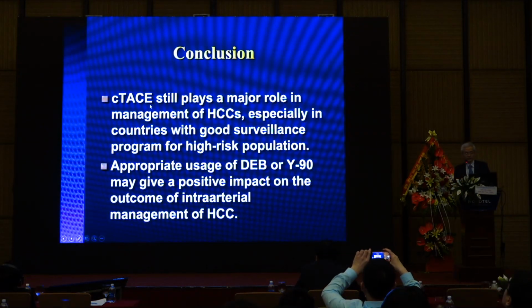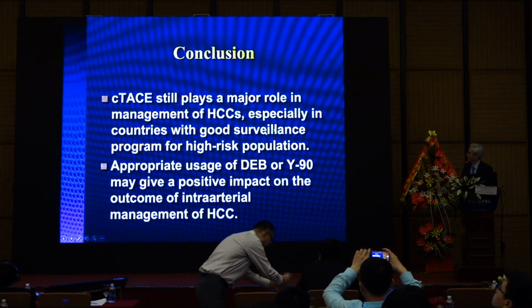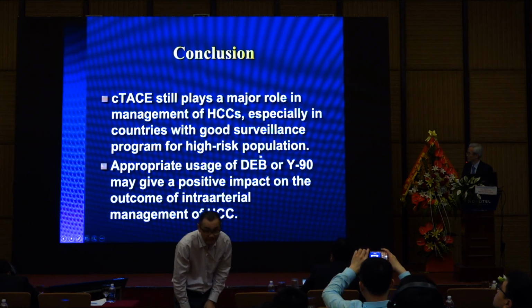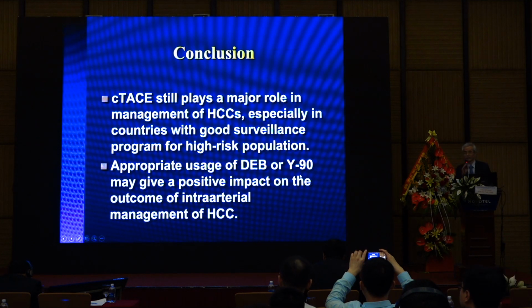In conclusion, conventional TACE still plays a major role in the management of HCC, especially in countries with good surveillance programs for high-risk populations. Appropriate use of DEB-TACE and radioembolization may have a positive impact on the outcome of intra-arterial treatment. Thank you for your kind attention.